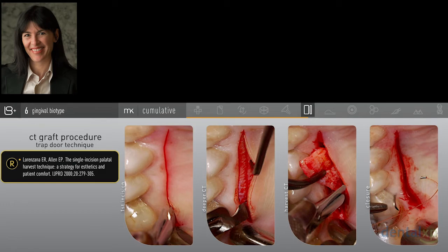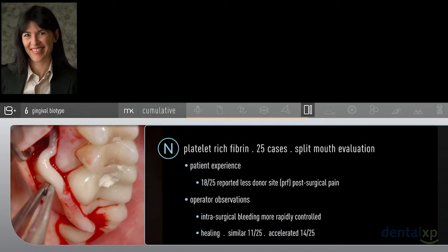But my key is here we're nicely taking a really good quality connective tissue, nice clean photographs. Worst thing for surgery is dry like this, right? So when we're working, I'm hydrating, I'm really irrigating to keep things lubricated to enhance how my patients heal. What does every patient say when they come in? I tell them I'm going to take a connective tissue graft in their palate. They look at me horrified, thinking, there's no way you're going to do that to me, because they think it's going to hurt. And we can position it and tell them it's going to hurt, but we're trying to do everything we can to make it a more positive experience where we feel that this is the right technique.